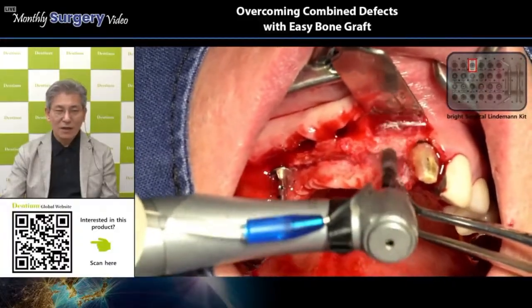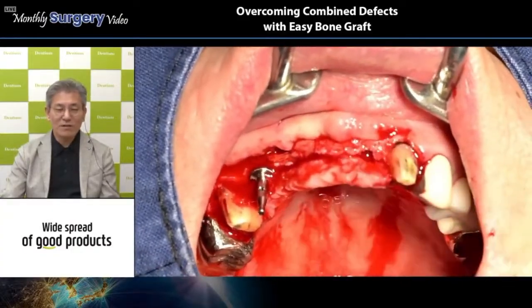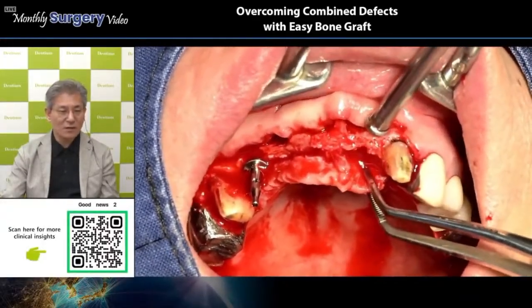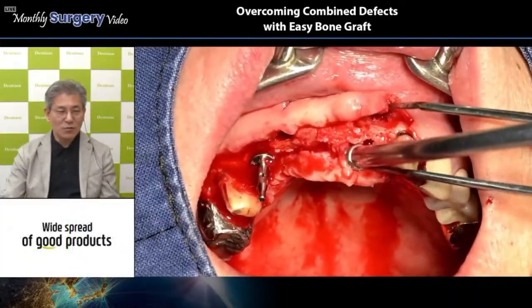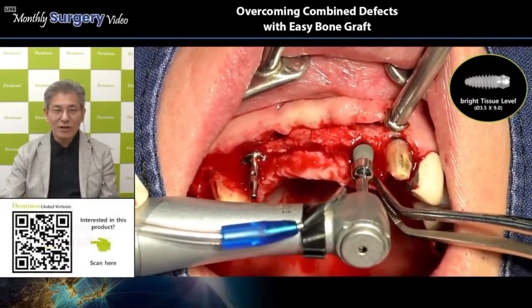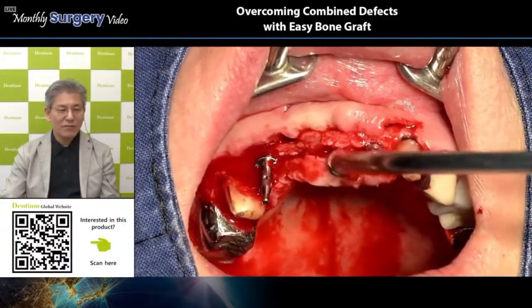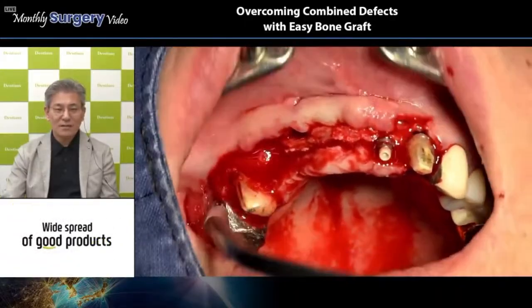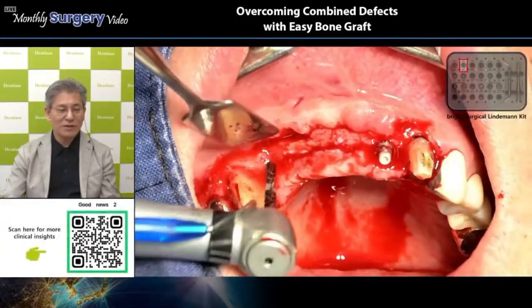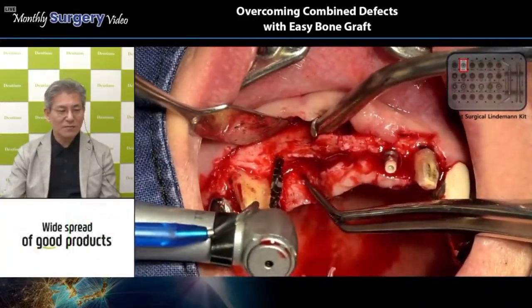The final aim, the final purpose of the implantation is to make a new implant supported prosthesis, right? So the positioning is important as well. Okay? Just the initial drilling, only 2 drillings, right? And then the placement, diameter 3.5. Undersized drilling was achieved, right? Until 3.0 final drill, and then go to 3.5 diameter because of this soft bone quality.